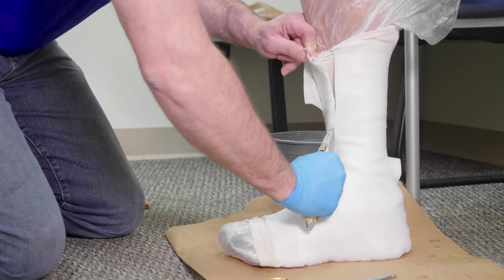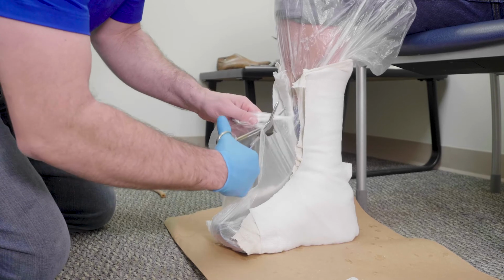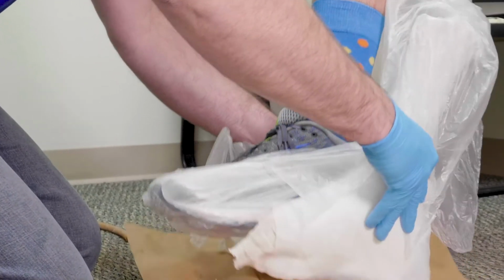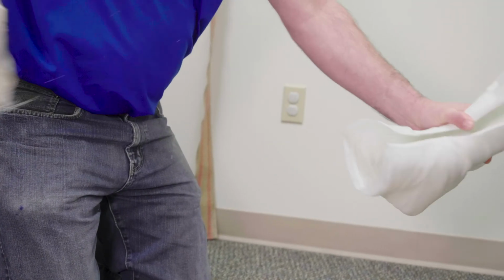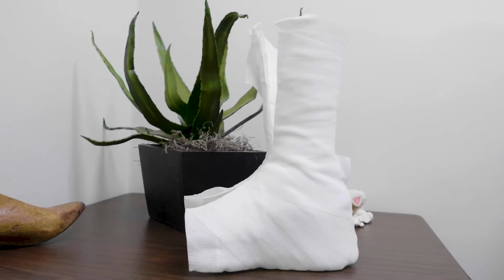Before removing the cast, use scissors to cut the bias stockinette and plastic bag from the patient's foot. Remove the plastic bag, bias stockinette, and cast from the patient. You can discard the stockinette and plastic bag. Now you have your finished cast. Send it to SureStep, and we'll take care of the rest.